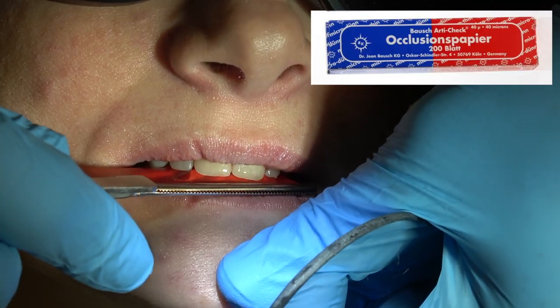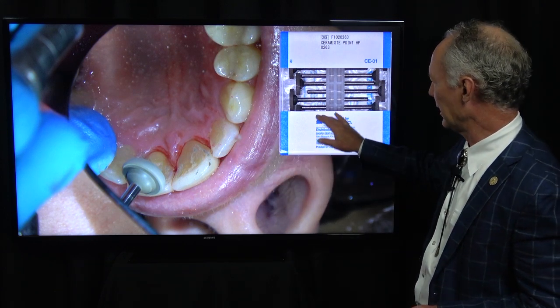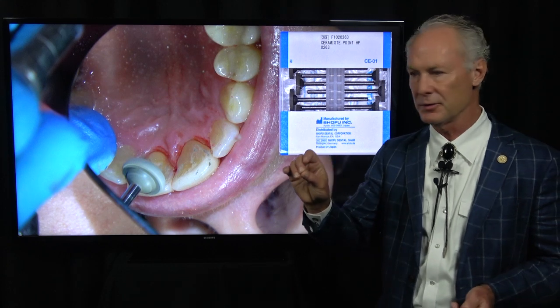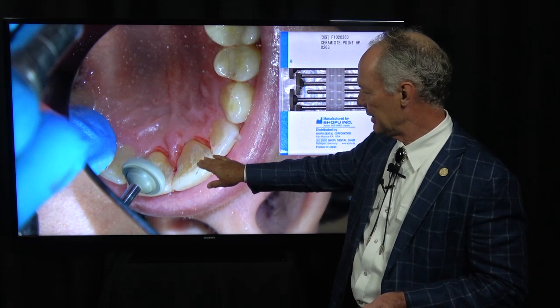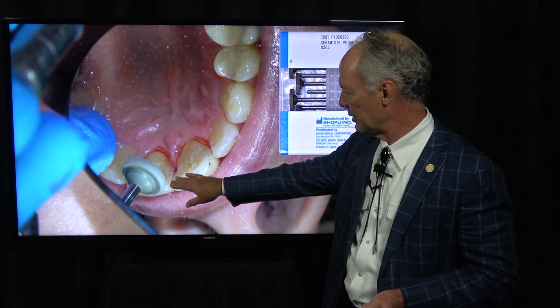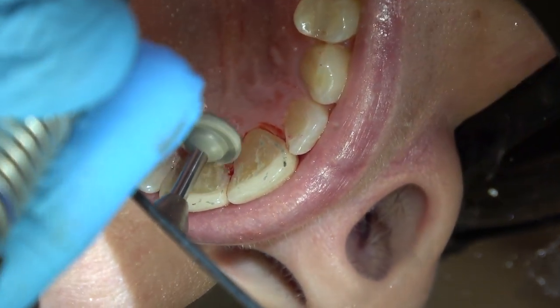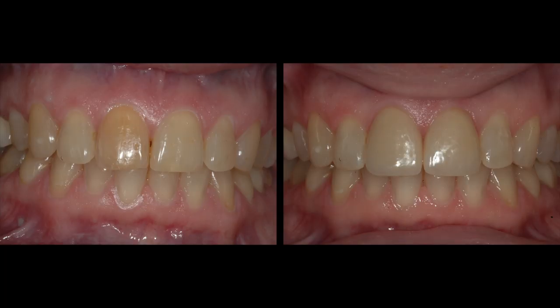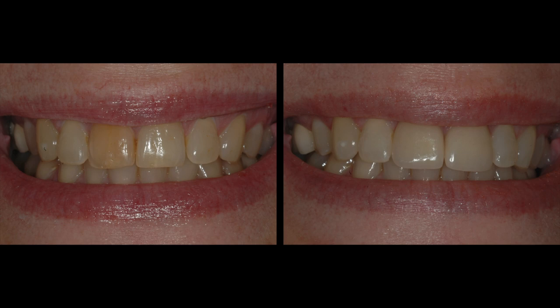Then I'm going to floss them and check the occlusion. Once I've adjusted the occlusion, I'll come back with the Shofu rubber wheels — these gray wheels — which are excellent for fine polishing. They remove any excess luting composite and finish it very nicely. I'll drip water on them as I polish. Here's a before and after — I think that's a nice shade match of a very difficult case. We've lengthened the teeth just a tiny bit, about half a millimeter. That's the Dental Minute — these techniques work, and they work every time.